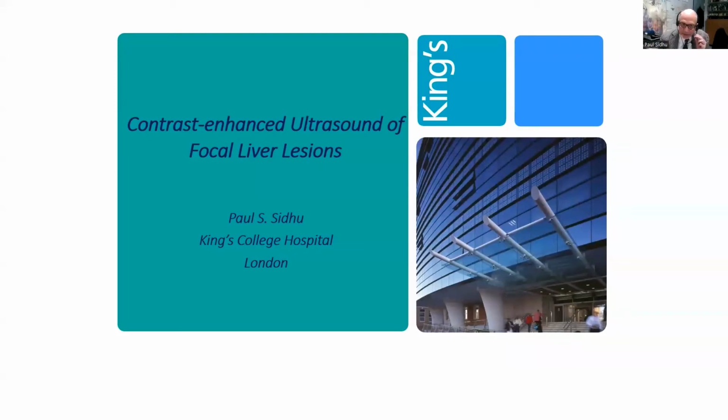Hello, I'm Professor Paul Sidhu from King's College Hospital in London, and I will talk to you about contrast-enhanced ultrasound of focal liver lesions.